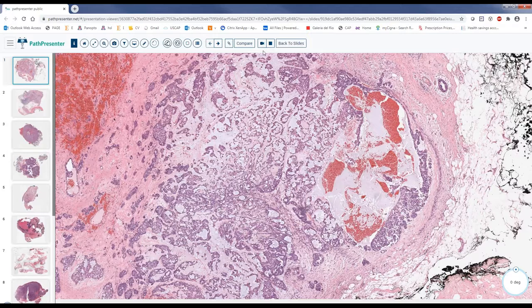What is the thing where there is a bulge here? Any word? Yes, excellent, pseudopodia. Pseudopodia means that it usually doesn't love to just be circumscribed like an orange. No, it loves to do some pseudopodia, it goes around.